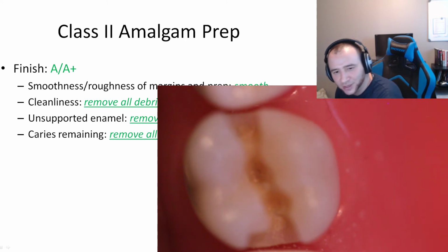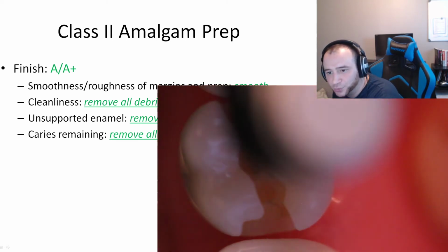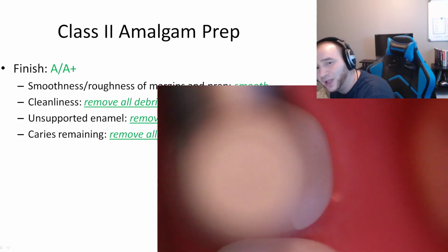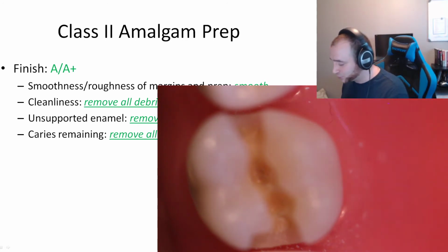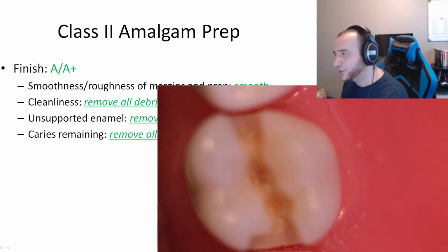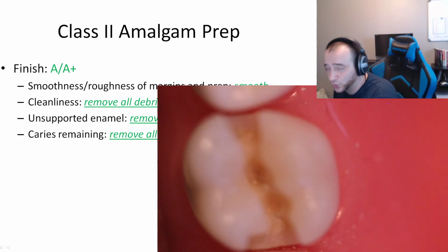Now, I want to say something again about the finish. You want to reduce the water a bit when you're doing the finish. So if you're going slow and you're pushing on the pedal halfway, you want to reduce your water a bit so that it's not too much water again. It makes it smoother as well. I noticed that when you have less water, it's easier to make it smooth. Okay, so I just went to smoothness.